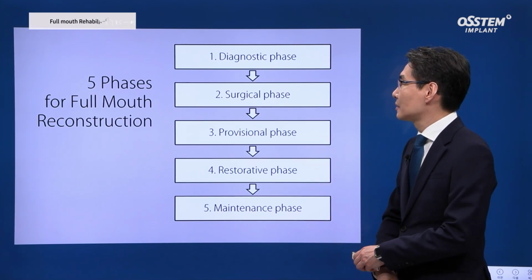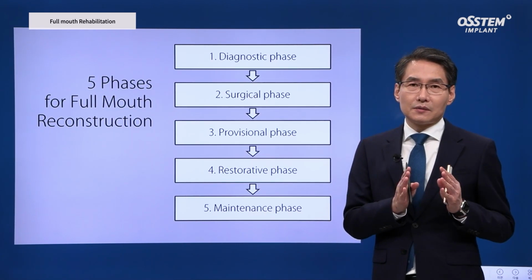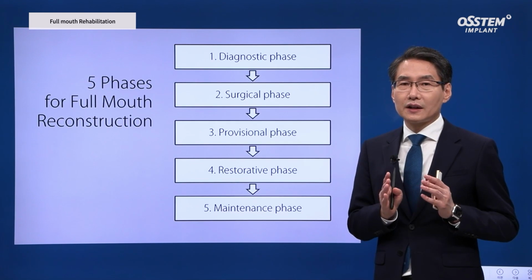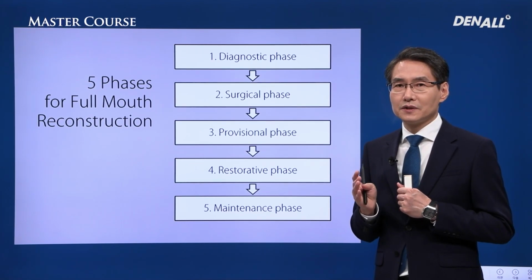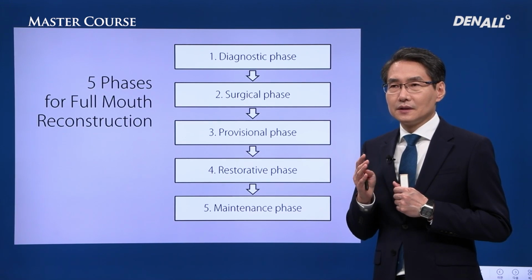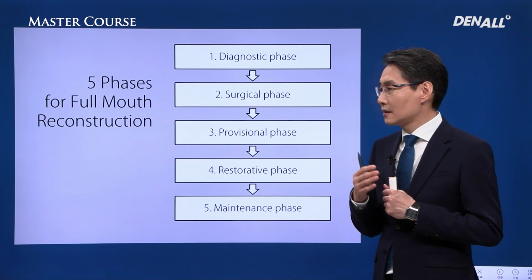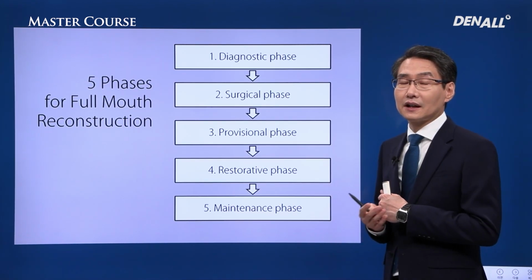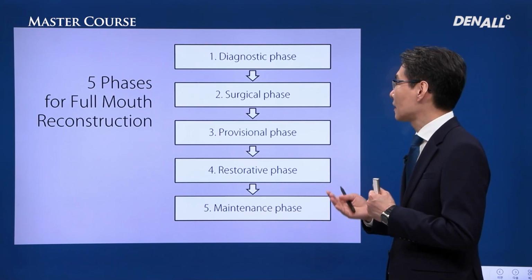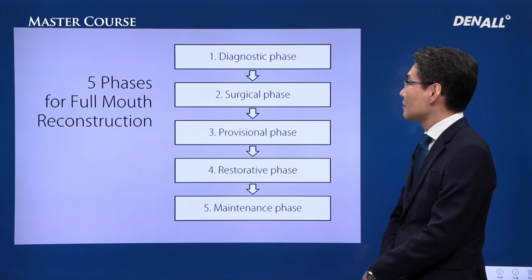As we treat partially edentulous cases, we need to enhance our skill, and this is the ultimate step that we need to reach. In the case of fully edentulous cases, because the prior patient's condition was extremely poor, the patient satisfaction after restoration delivery is very high. Implant treatment itself is excellent, and for edentulous patients, if you provide fixed prosthesis, you can dramatically improve the patient's quality of life as well as systemic health, and I think this is an excellent procedure.